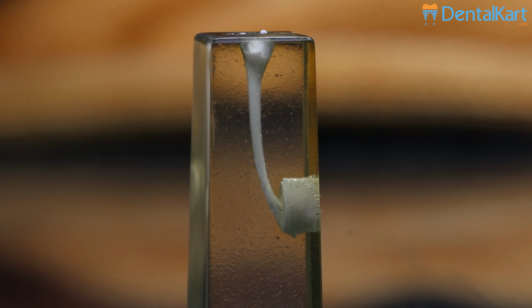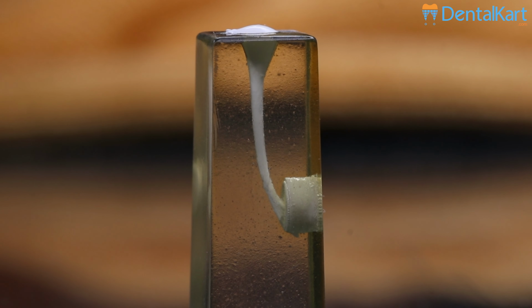For even placement of RCTcal within the canal, take a master cone up to its working length and then make sure that the material is delivered up to the apex. Remove the excess material with the help of a sterile cotton swab.